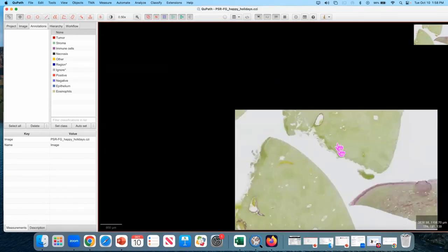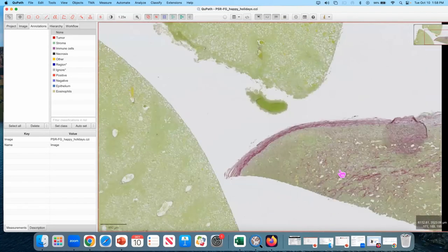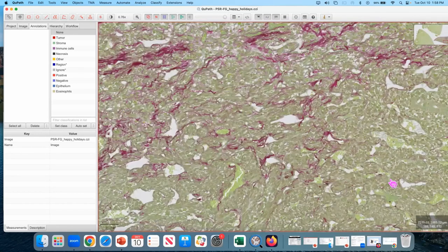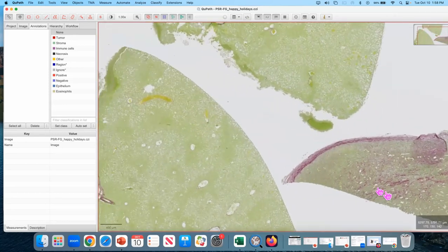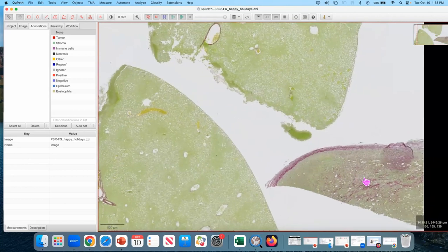Another piece of liver showing the same thing. And then there's this tissue. I spent a little bit of time trying to figure out what this was. There are some medullary cords. I was thinking it's adrenal. But then when I saw the big blow-up image, the LOMAG image that Sara just showed, it's a little too big to be adrenal.